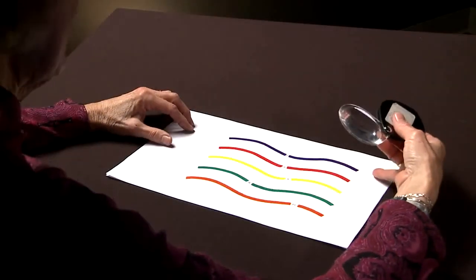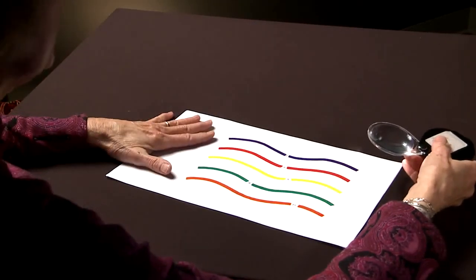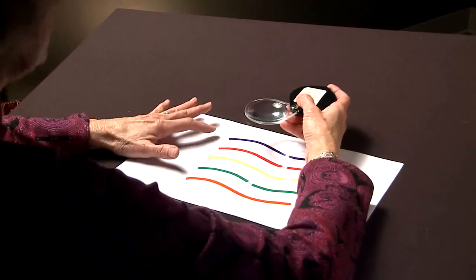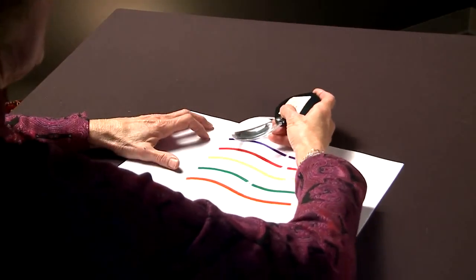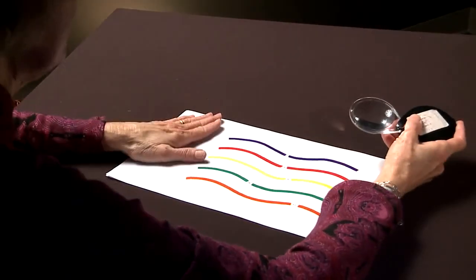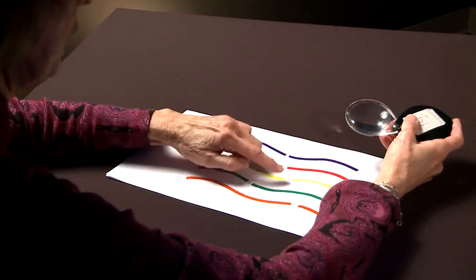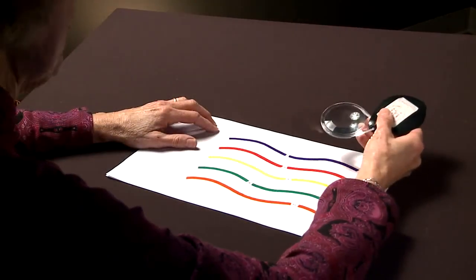When you're working on scanning with a student, your materials are going to get progressively a little more difficult, but the goal here is to maintain a steady fixation. You could do this with a stand magnifier, and to learn that left to right, up to down progression that's smooth. On this little worksheet, I have lines that are different colors, and in the middle I have a letter of the alphabet printed very small because I want them to be able to see it through magnification.